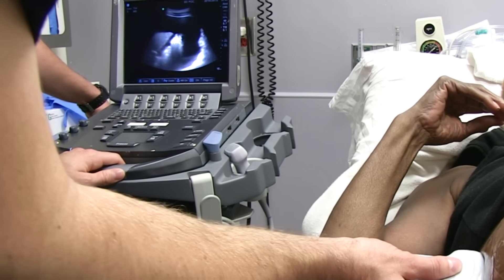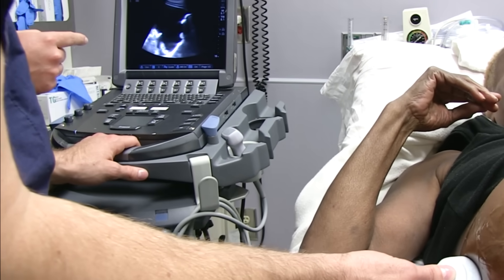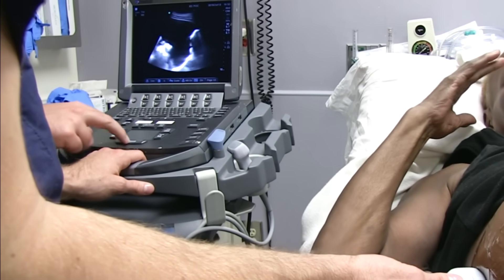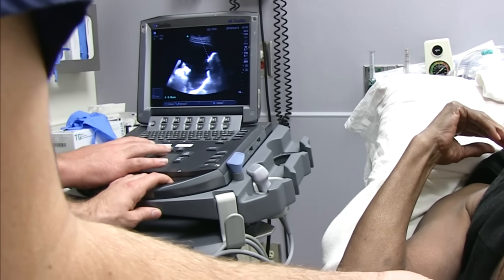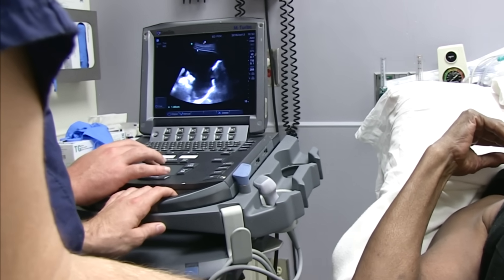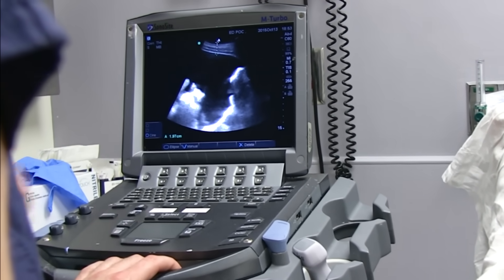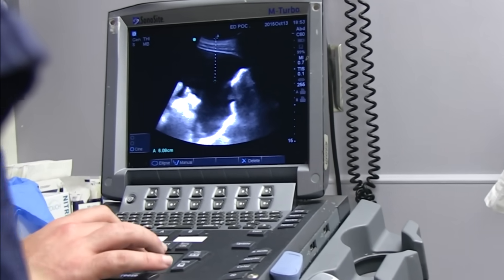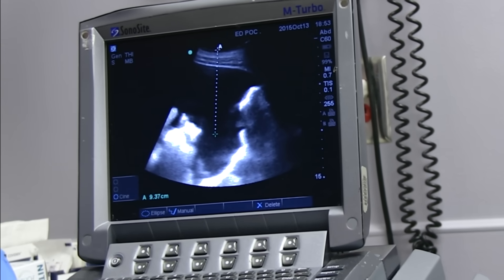We want to go as far posterior as possible to maximize the amount of fluid we can get. Come a bit superior, cephalad — right there, great. Hold that spot. You can see right here, measuring from the probe surface to the peritoneum: 1.97 centimeters.